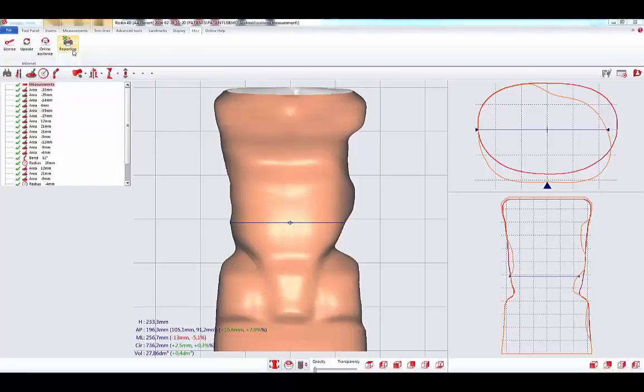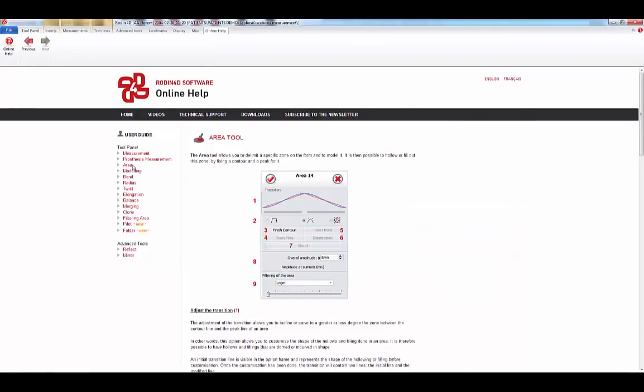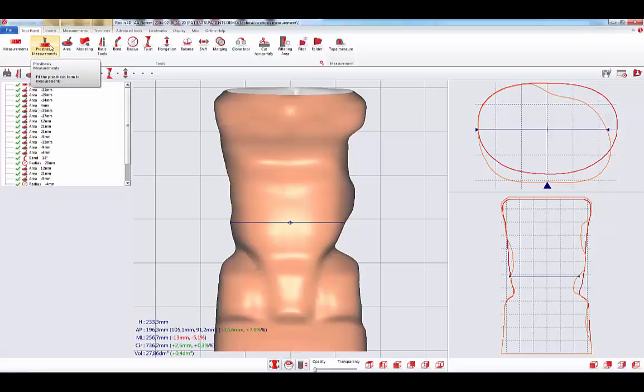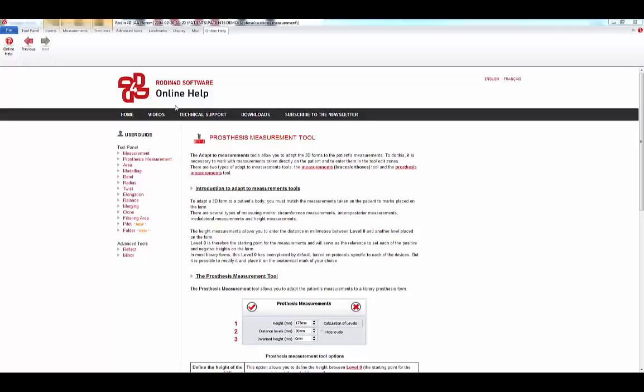Another new functionality of Rodin 4D Neo is the Online Help. There you will find explanations with videos and text about every tool. You can also access this help by tapping F1 from anywhere in the interface. It redirects you to the right page on the Help Online.